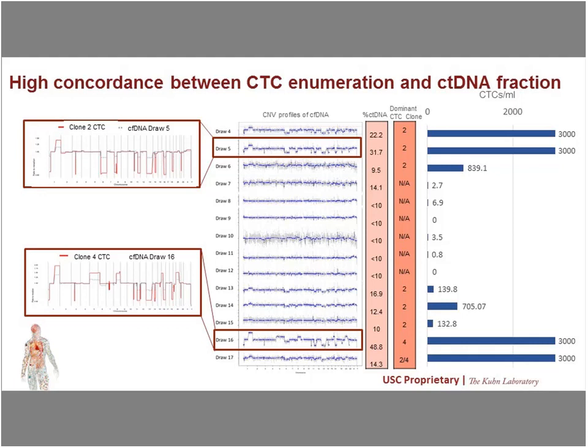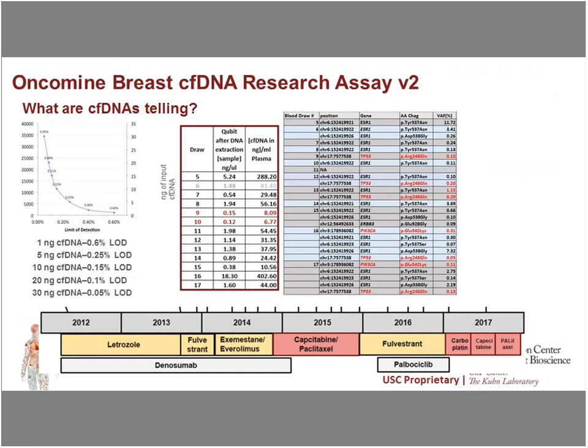So here is the overview for all our plasma samples. This is the CNV result. And what about SNVs? Here at the bottom is the treatment information and the timeline. We try to understand why the only treatment that the patient responds to is chemotherapy after relapse on letrozole, and none of the hormonal drugs appears to have a sufficient effect on keeping her tumor markers in check.